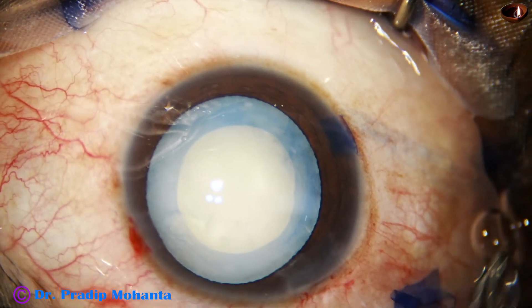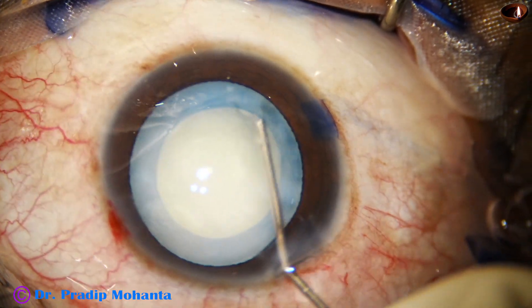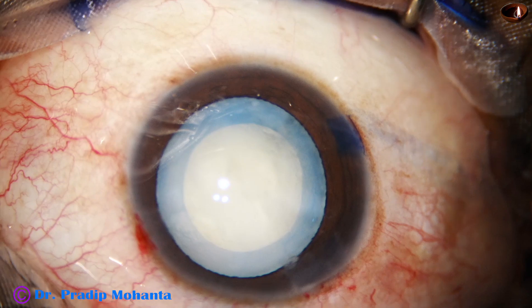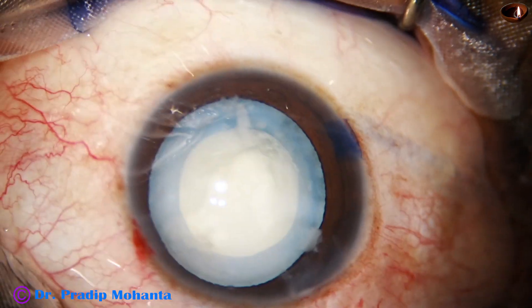A little bit of hydrodissection is done — not much hydrodissection is required in such cases. The nucleus is stabbed and I find that the nucleus is very soft.